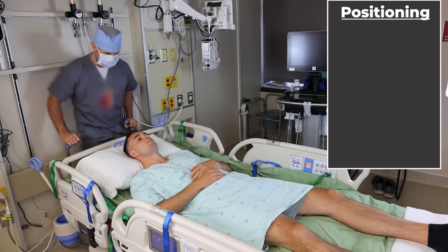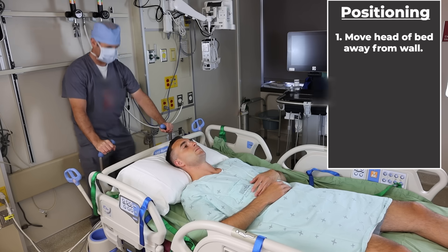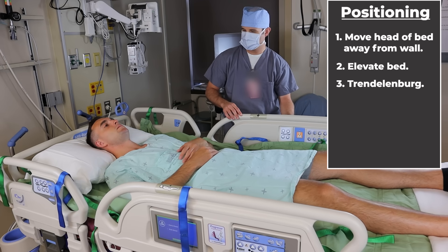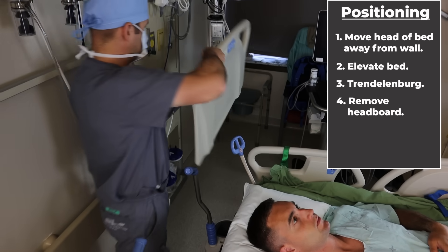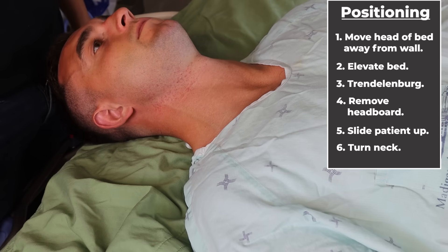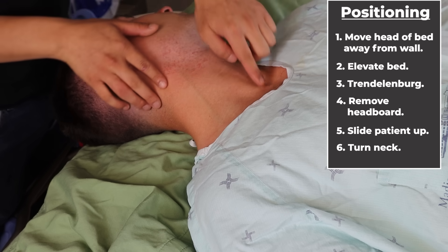First, he unlocks the bed and moves it so that there is ample room at the head to stand. Next, he elevates the bed to a comfortable working height. Then he places the patient in a little bit of Trendelenburg, which helps to engorge the veins of the neck. He takes the headboard off the head of the bed, and then we slide the patient as far up as he'll go. Finally, gently tilt the patient's neck off to the side.